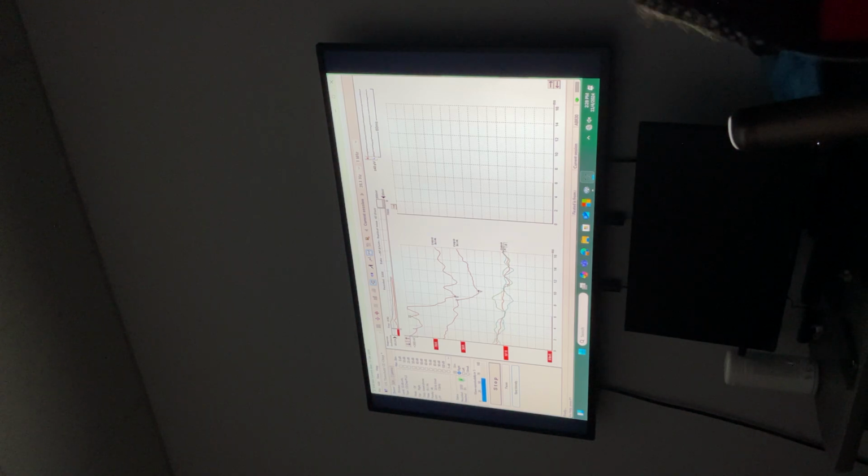This is a little too far. This is what we're looking for. What do we do now? The sound is too big. Can we retest 10? Yeah, we'll just recheck. Or do 15. No, we'll only use 10 dB steps. No, 5 dBs. So this one is emerging there, right? So this is a possible candidate.